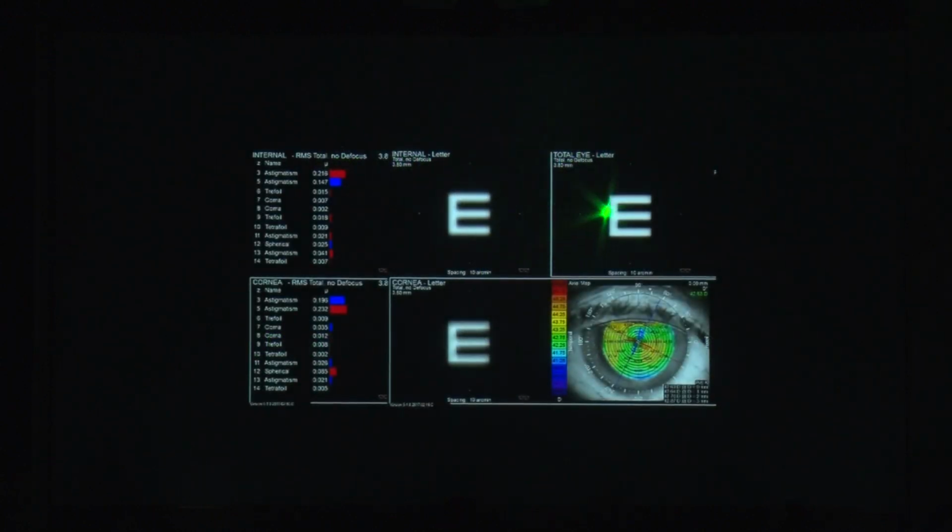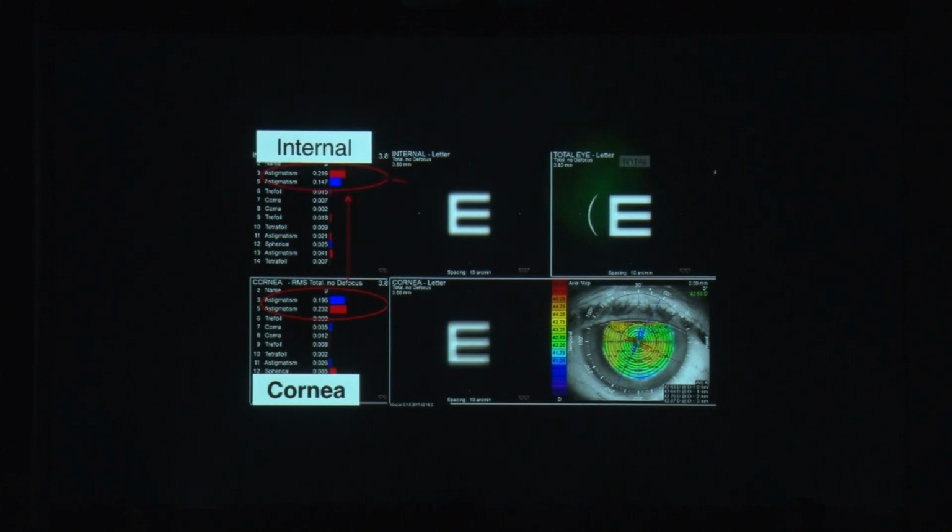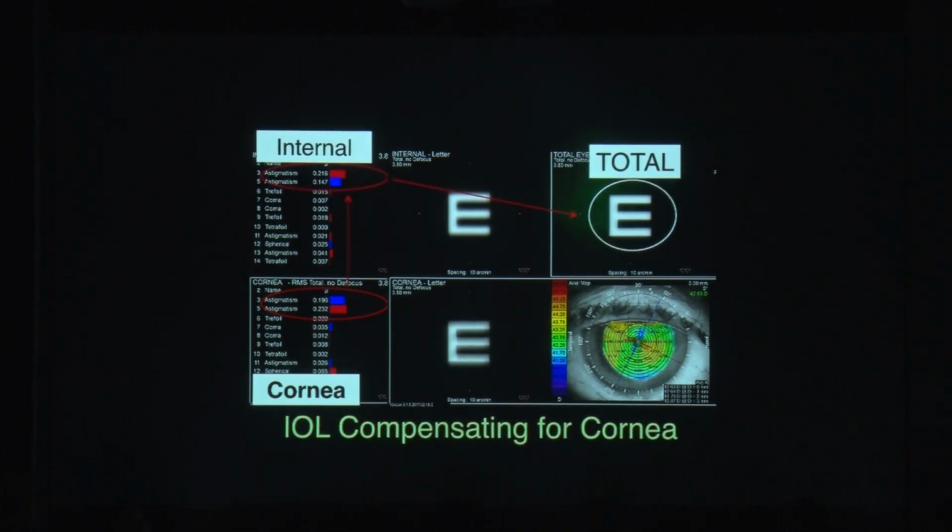And this is the postoperative picture in that other eye where we did a monofocal toric IOL. Again, like I said, just because the patient was so scared of having a multifocal. So many times the multifocal lenses get a disrepute just because they were left with a residual cylinder. So that is another point, that we need to explain to this patient that it's not the multifocal, it's just that you have some astigmatism.